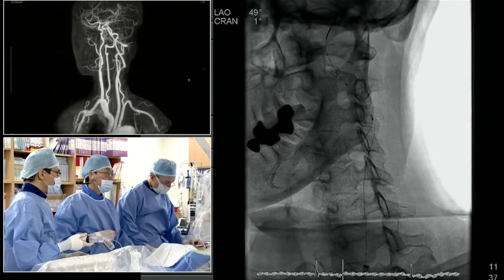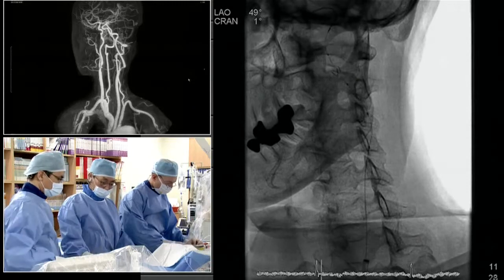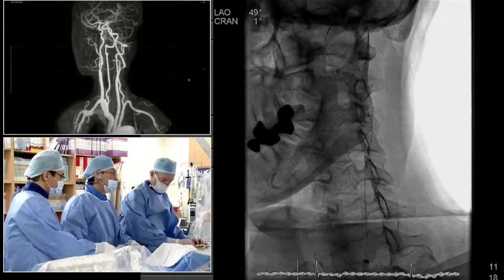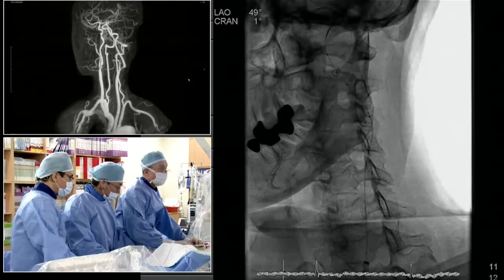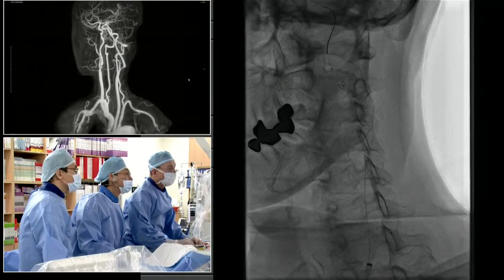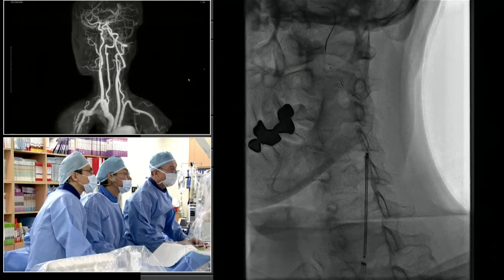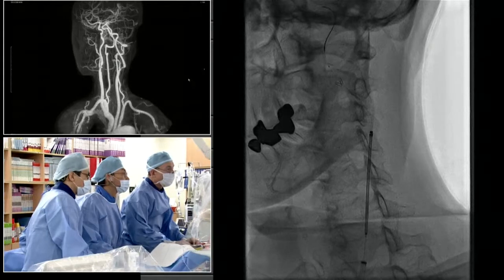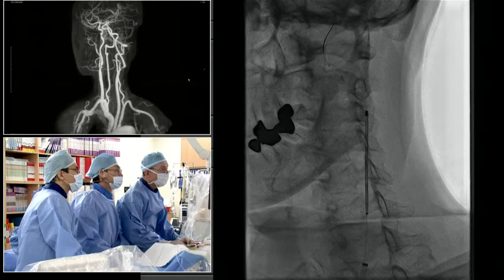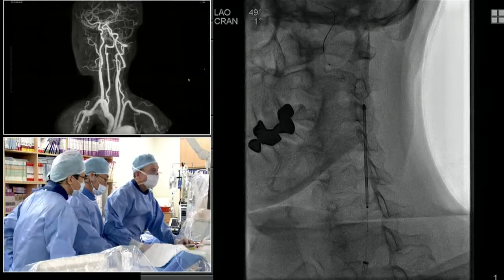So any thoughts from the panel on open cell design, closed cell design, or other thoughts around stent choice? So Sievert, what would your choice of stent be here? Well, it's actually a little bit banded, so I think it doesn't make a big difference here. Probably I would use a more flexible stent here, like Cordis or, what is this one? So this is a carotid wall stent. Wall stent. Yeah, and I chose that because of the nature of the curve.